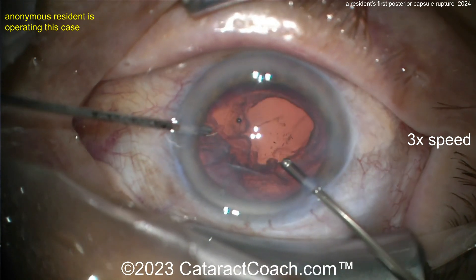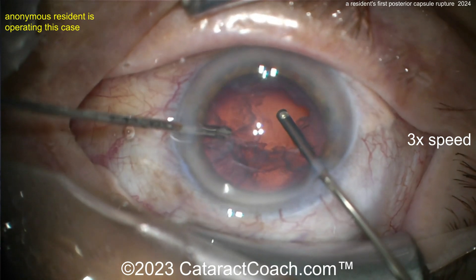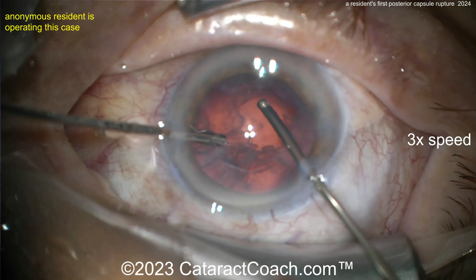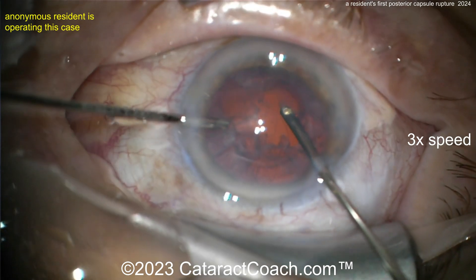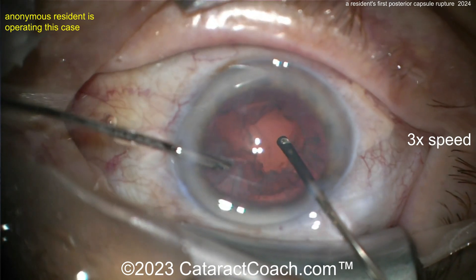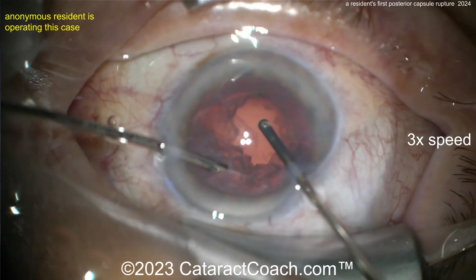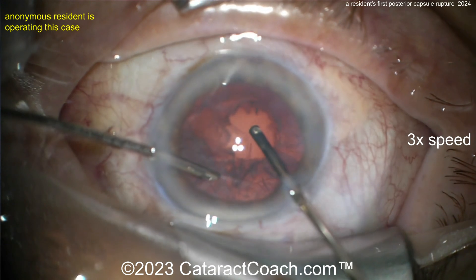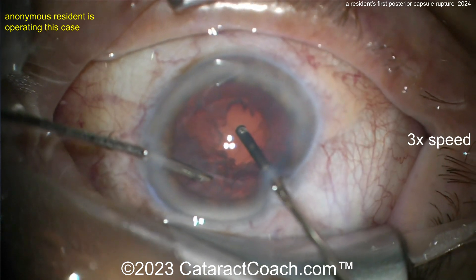Abandon your main incision and switch to a pair of instruments — the vitrector. With your right hand, start anterior vitrectomy to address the prolapsed vitreous. Position one is irrigation, two is the vitreous cutter, three is aspiration. Use your non-dominant hand to inject triamcinolone acetonide into the eye to stain the vitreous so you can see where it is.